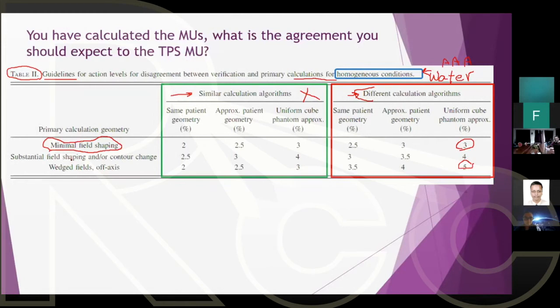If you have substantial shaping, مثل الهودجكنز, if you're doing, you know, non-Hodgkin's lymphoma, APPA, very complicated shape, ولا inverted Y, تمام? Or you have a contour change. Contour change, so your patient is not a block of water. Where is the most visible contour change؟ وين أكتر شيء في جسم الإنسان لما نعالجه بيكون أكتر شيء بيكون فيه contour change هو البريست. Breast has the worst contour. Breast is really سهل الممتنع. Treating breast and verifying a breast plan is a headache.